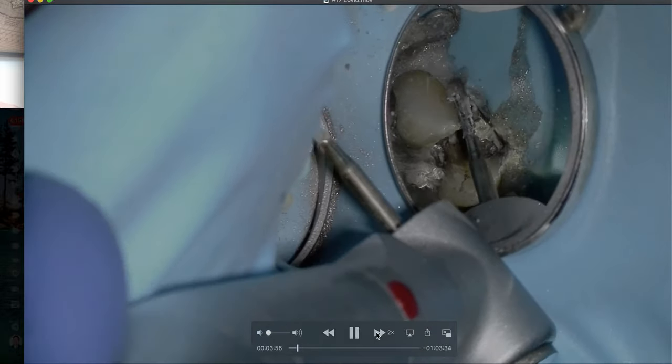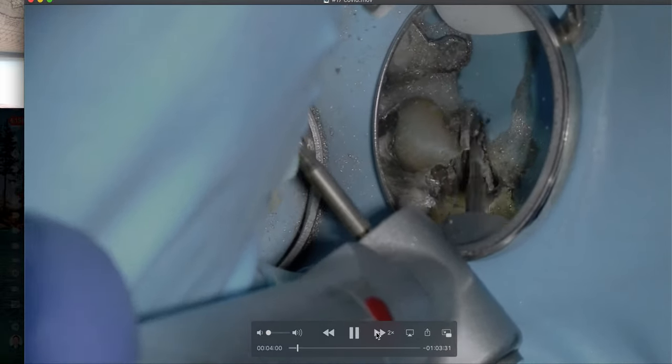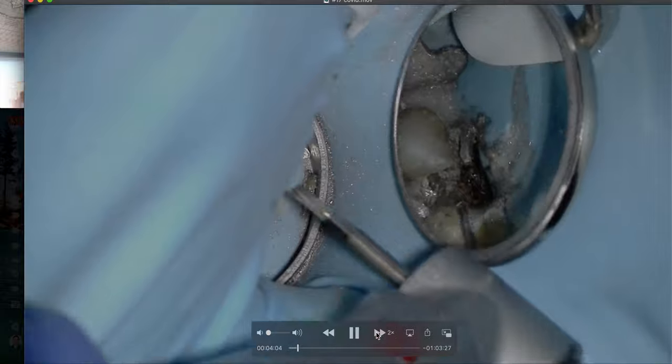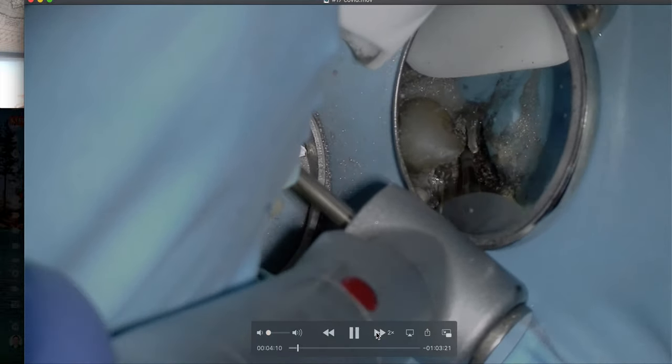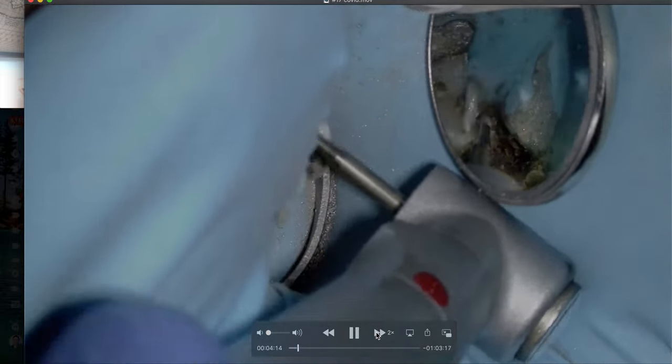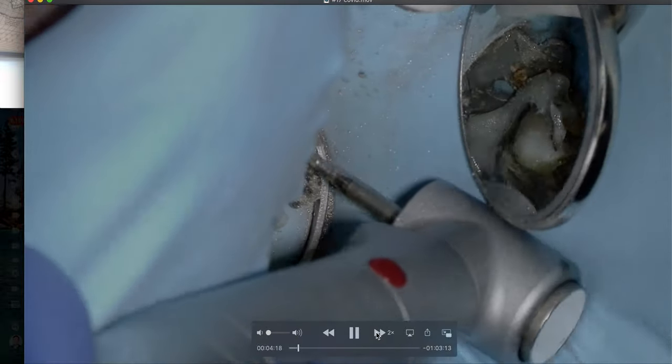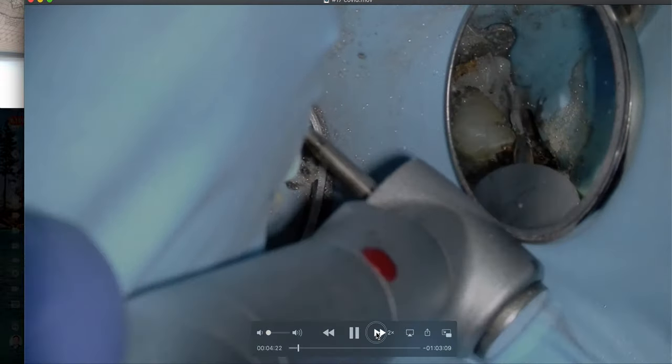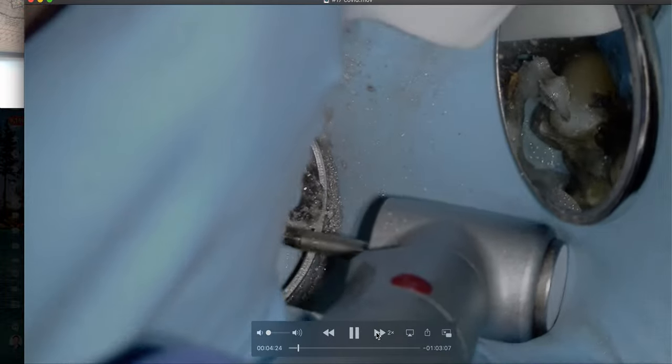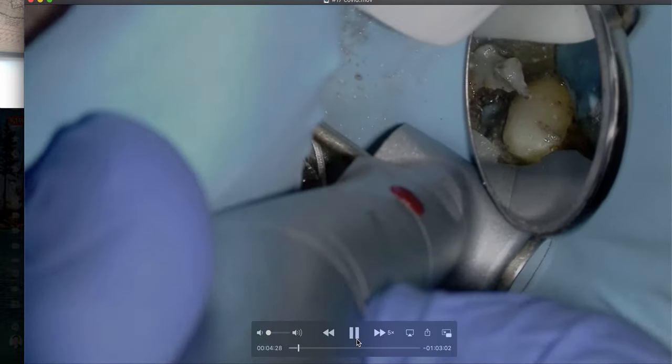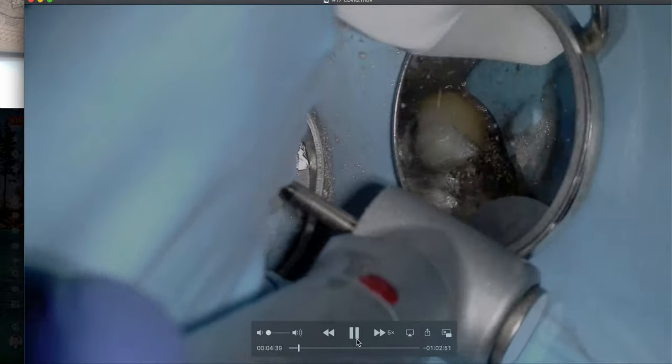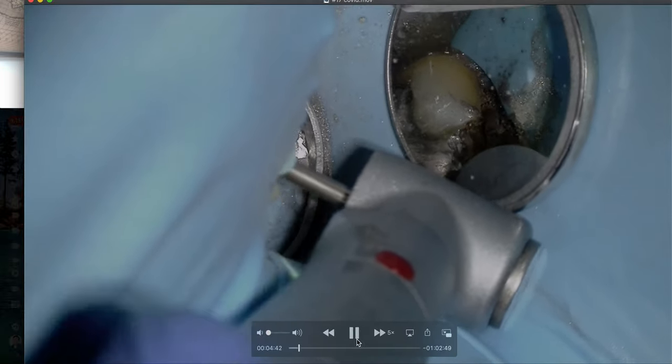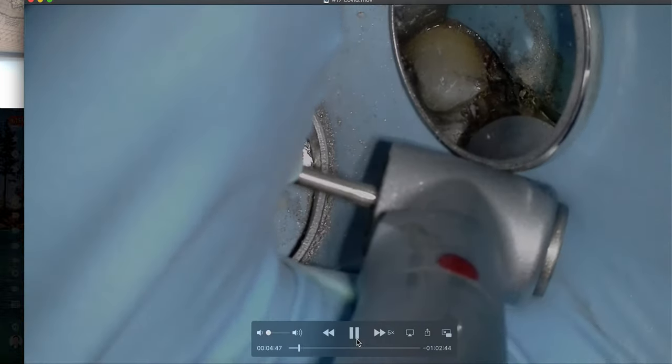So you can see once we break the seal, the seal works really well to keep the saliva out. Because we're removing that restoration just to make sure that the tooth is restorable. So we remove that restoration there. And then you can see the saliva start flowing in. So that's one of the reasons why we do use that secondary seal.